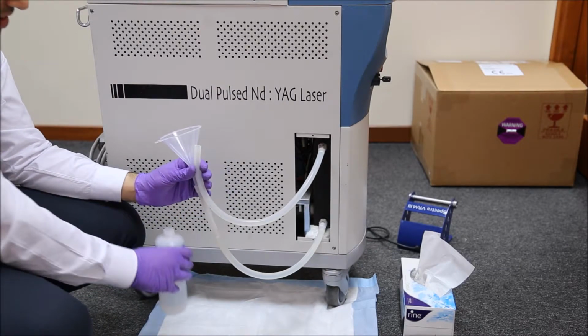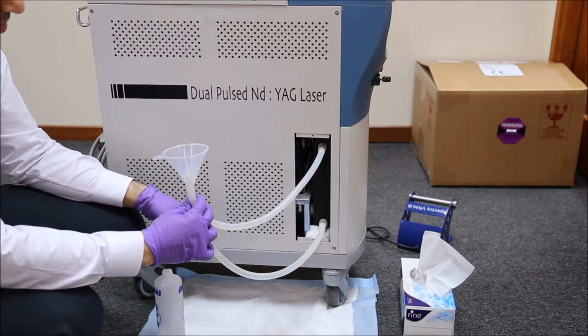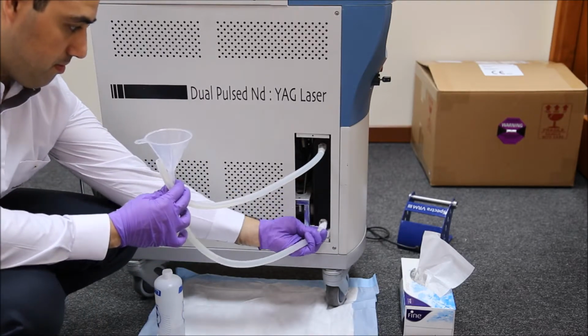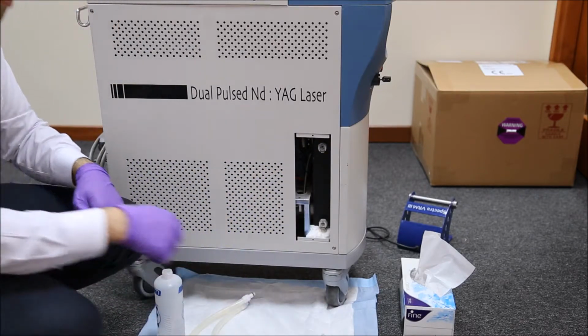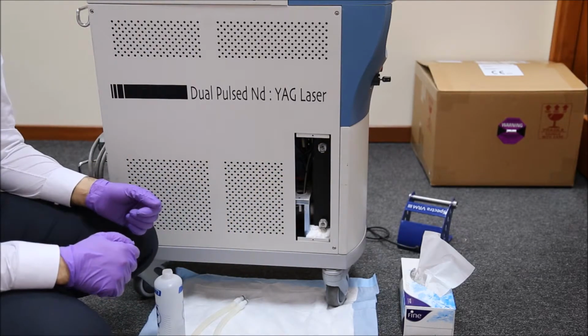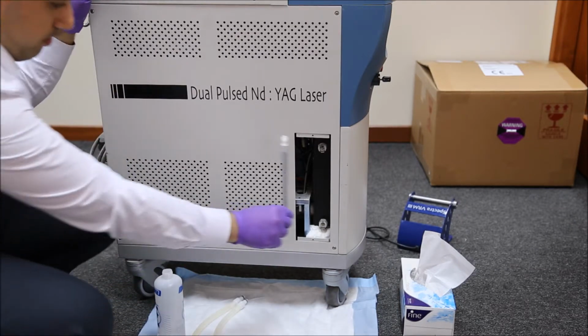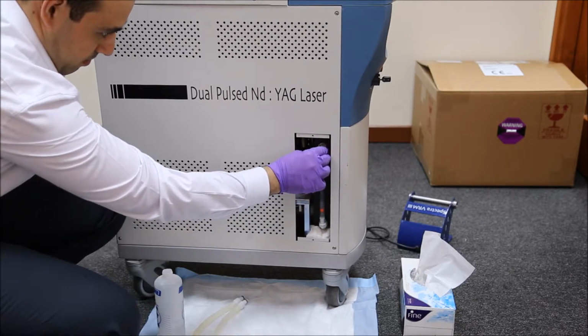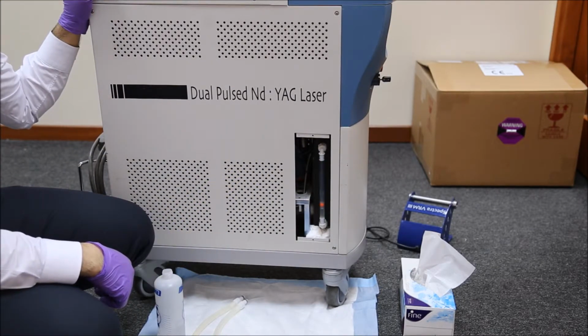7. Once the cooling water tank is filled with distilled water to the top, pull out the funnel and the tube from the inlets of the tank. 8. Connect the indicator tube to the tank by pushing the connector of the tube into the inlets of the tank. Then the indicator tube is filled up with distilled water to the water level of the tank together with the ball. It is proper that the water with the ball is filled up to the proper water level.